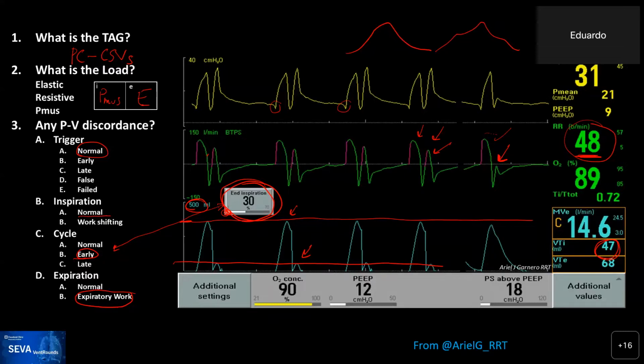Yeah, NAVA is another one, although I would say, and this is another one of the items that we put in that editorial, if I ask what is the most common reported patient-ventilator dyssynchrony pattern in NAVA, what do you think it is? All of these that are here, what is it? Yeah, but which one is the most frequent, Rob? Of all of these ones over here, which one? Well, actually, it's not even here.